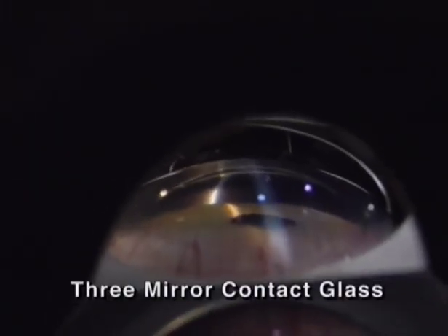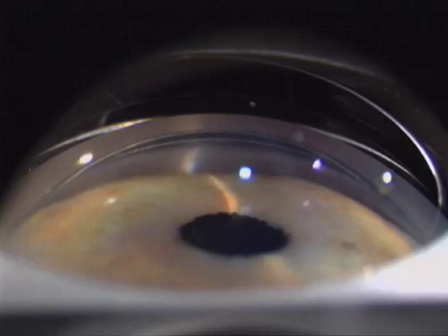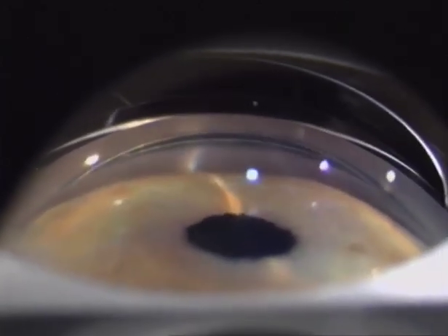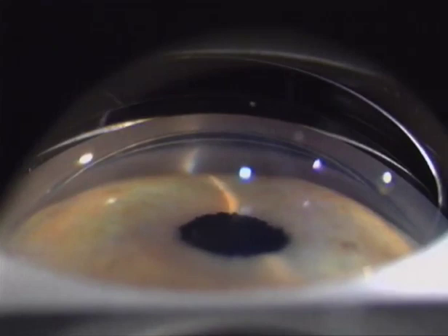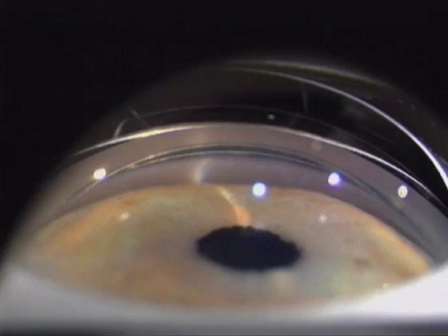Problems with 3-mirror contact glasses. When using the 3-mirror contact glass with a limbal mirror, we see the slit light discontinuous and the anatomy of the angle is invisible. When slightly shifting the contact glass, the discontinuity of the light slit decreases and we obtain a view on Schlemm's area in the trabeculum. Note again the discontinuity of the slit as a sign of obstructed view into the angle, and the decrease of the discontinuity when the access to the angle has improved.